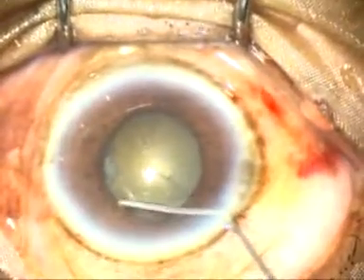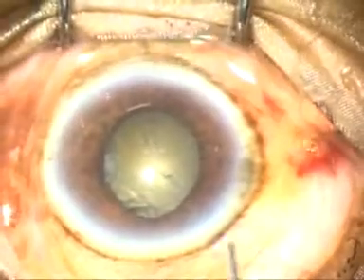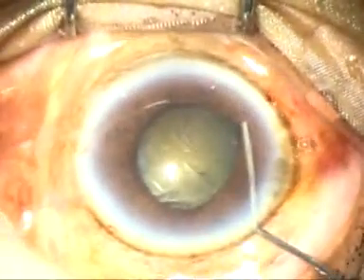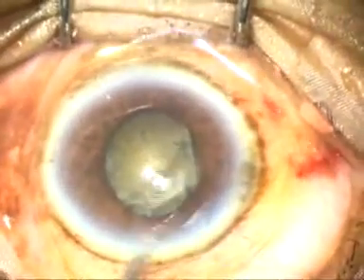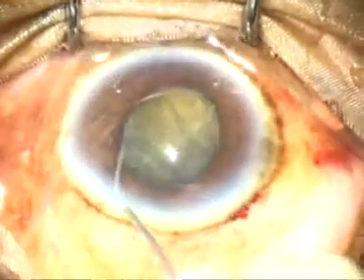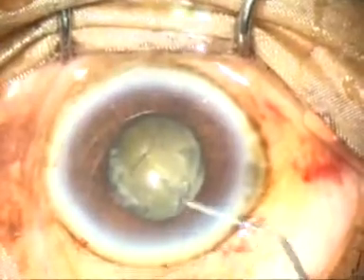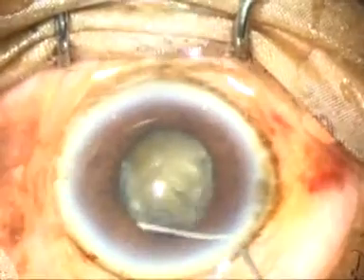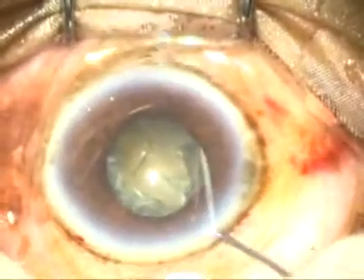How to do hydrodissection: go along the surface of the cataract underneath the anterior capsular rim and hydrodissect a little bit at multiple points. Now try to mobilize the nucleus. The lens is moving but I want more free movement, so I am doing some more hydrodissection.